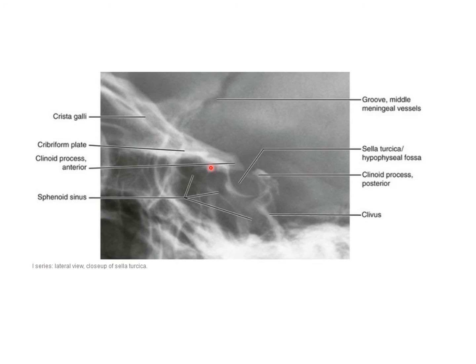This is a close-up view of the lateral skull x-ray. Here you can see the sella turcica, groove for the middle meningeal vessel, cribriform plate clearly, and the crista galli, then the anterior clinoid process and posterior clinoid process. You can also see the clivus, and just below the sella turcica you get the sphenoidal air sinus.